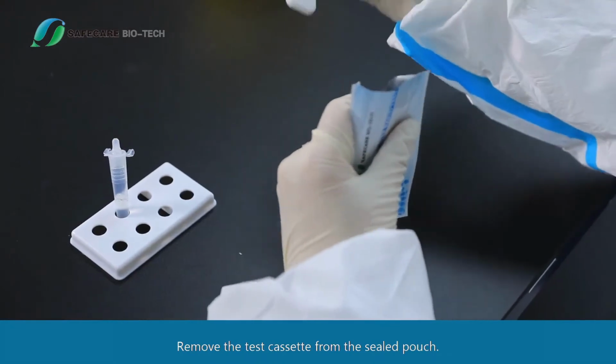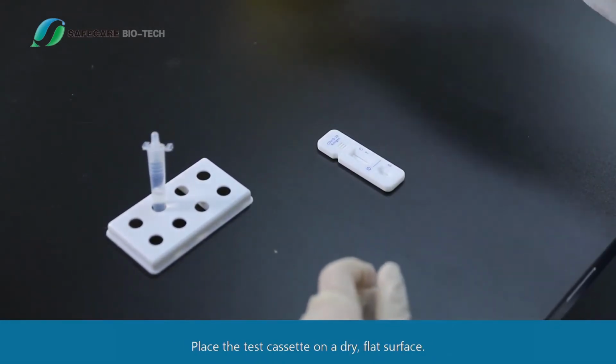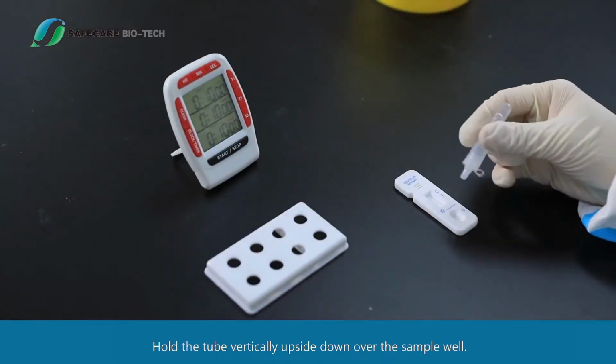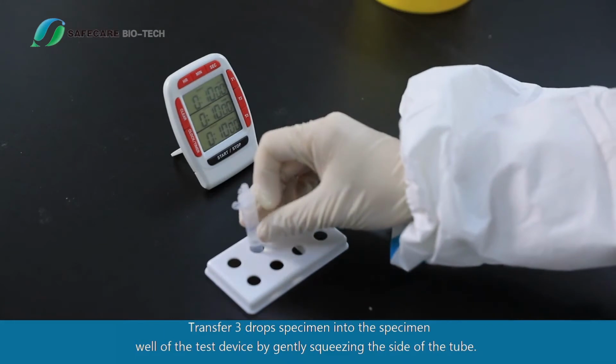Remove the test cassette from the sealed pouch. Place the test cassette on a dry, flat surface. Hold the tube vertically upside down over the sample well. Transfer 3 drops of specimen into the specimen well of the test device, by gently squeezing the side of the tube.